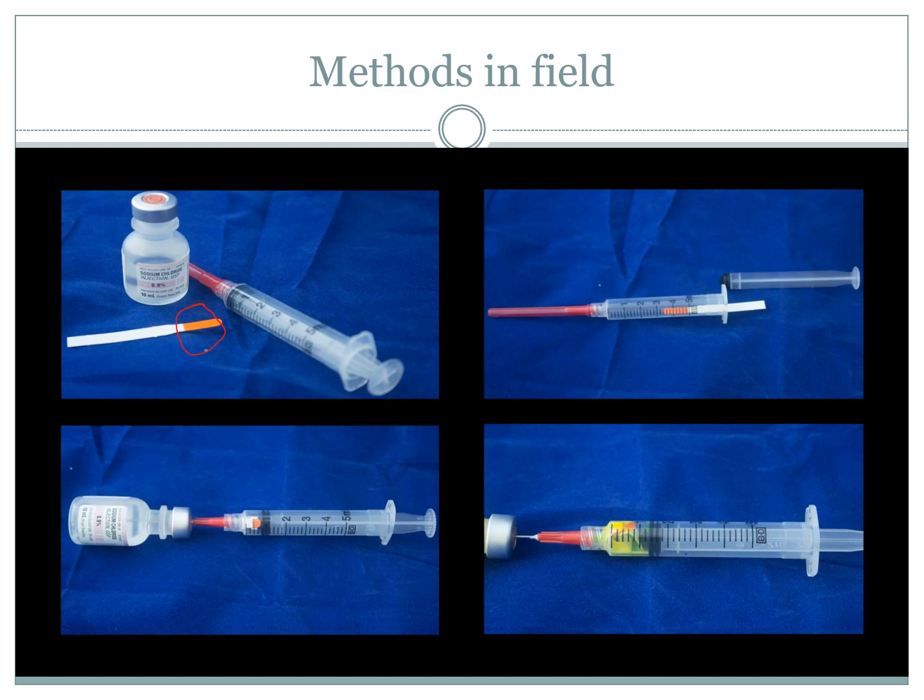So another option is you can place the strip itself in a syringe and then draw up 1 to 2 mils of fluid. Normal saline for injection is fine, and then wait for that fluid to absorb the Fluorescein from the strip. So therefore you'll have a solution like the drops that you've created yourself that doesn't need to be refrigerated.